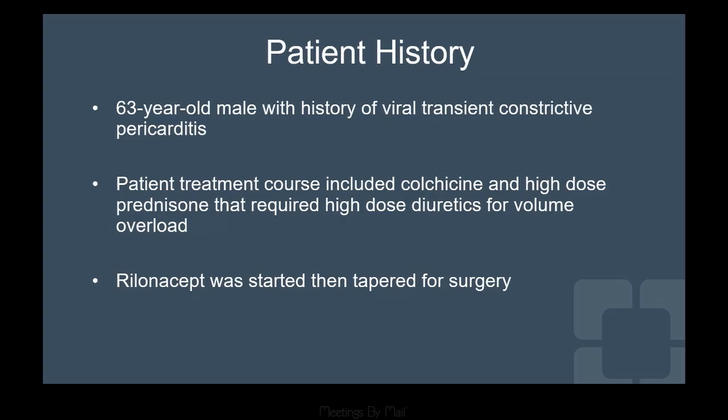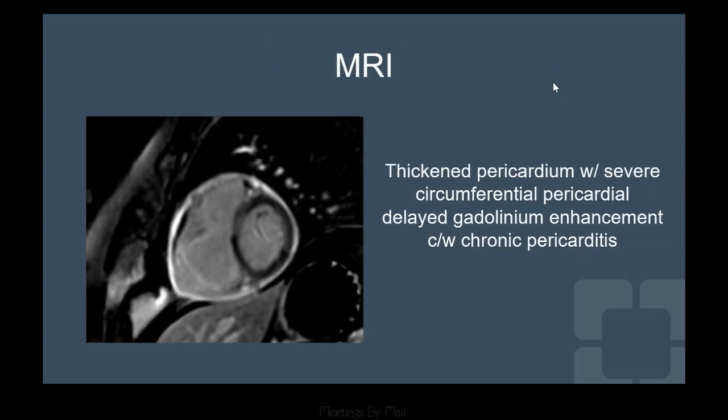Okay. So the patient's treatment included anti-inflammatories as well as diuretics, and rilonacept was started and tapered for surgery. Rilonacept is a biologic. Actually, after this session, one of the non-CME sessions involves that biologic. Okay, next. I know this is mainly echo, but this MRI tells 1,000 words. This picture tells 1,000 words.